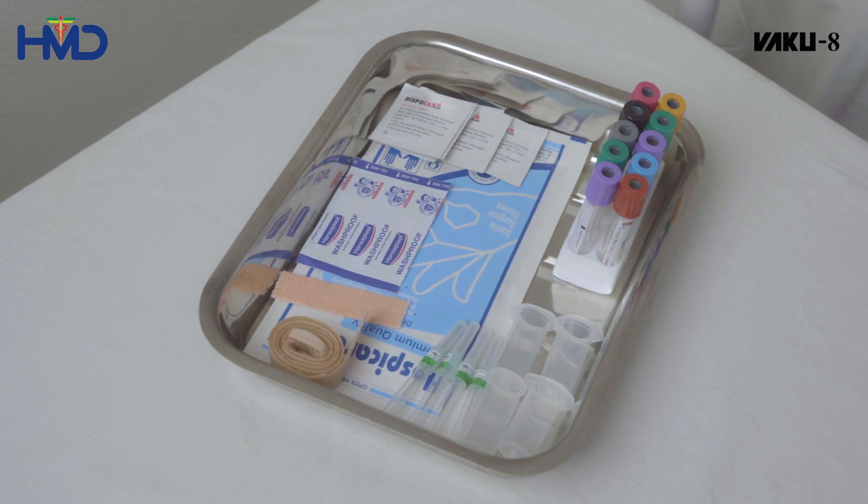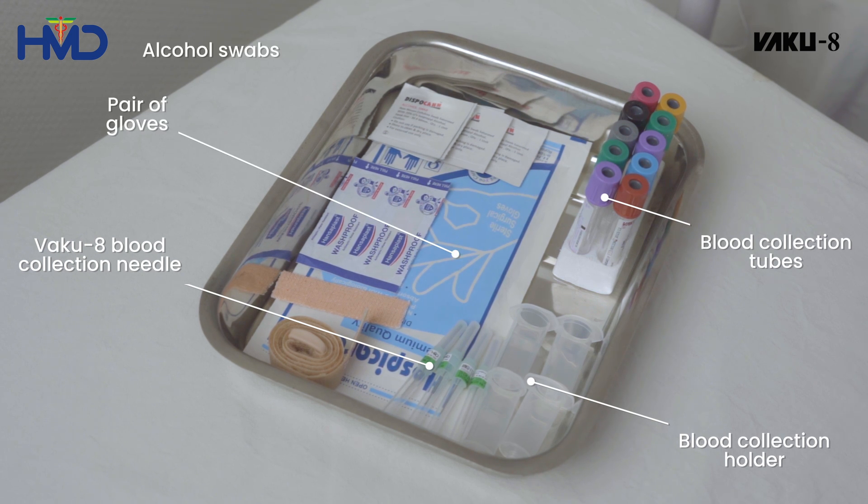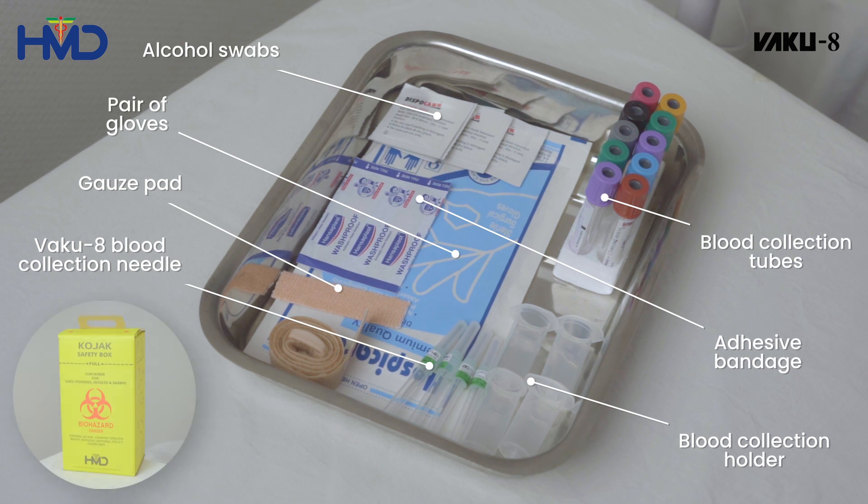Before drawing the blood sample, keep the following things on the collection tray: a new blood collection tube, a new VAKU-8 blood collection needle, a blood collection holder, a pair of gloves, alcohol swabs, a gauze pad, an adhesive bandage, and a sharps container.